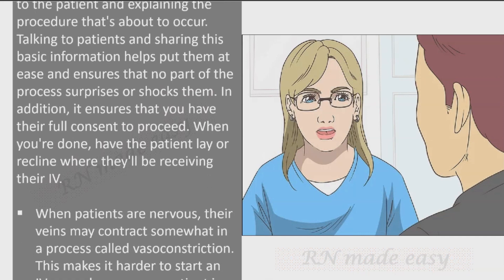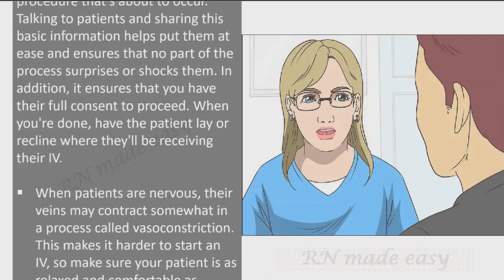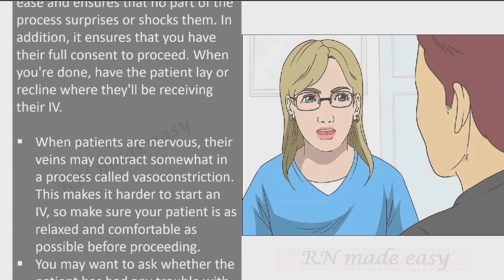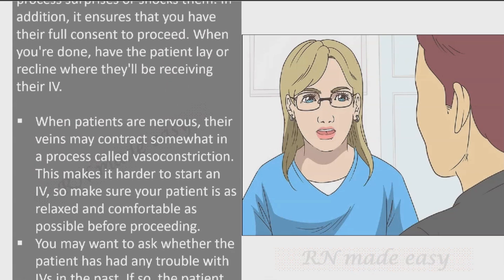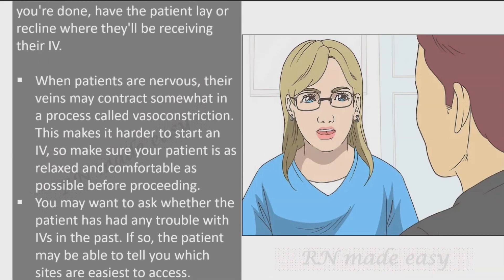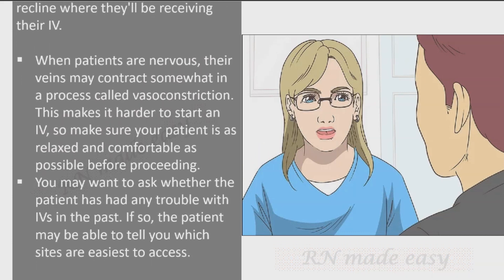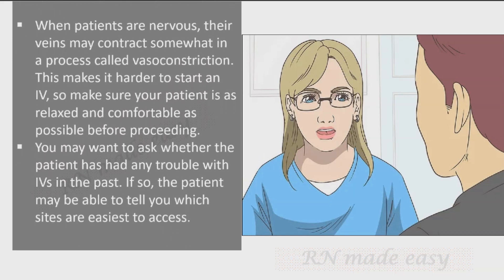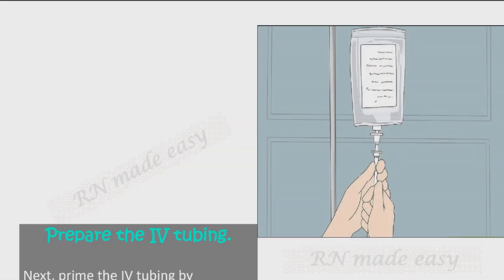When patients are nervous, their veins may contract somewhat in a process called vasoconstriction, making it harder to start an IV. Make sure your patient is as relaxed and comfortable as possible before proceeding. You may also want to ask whether the patient has had any trouble with IVs in the past — they may be able to tell you which sites are easiest to access.